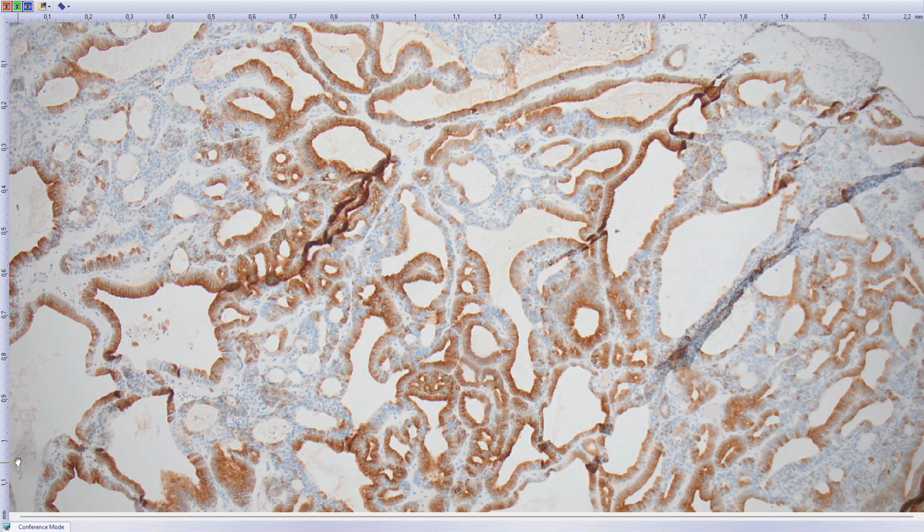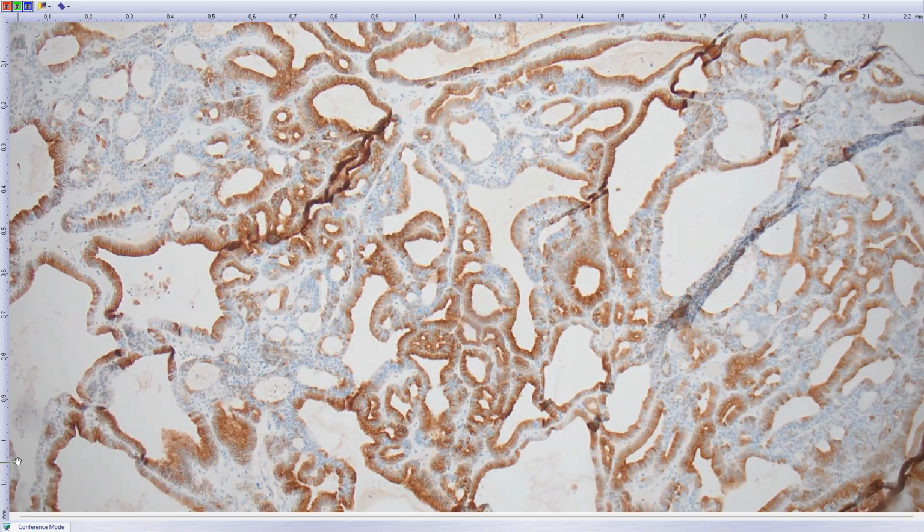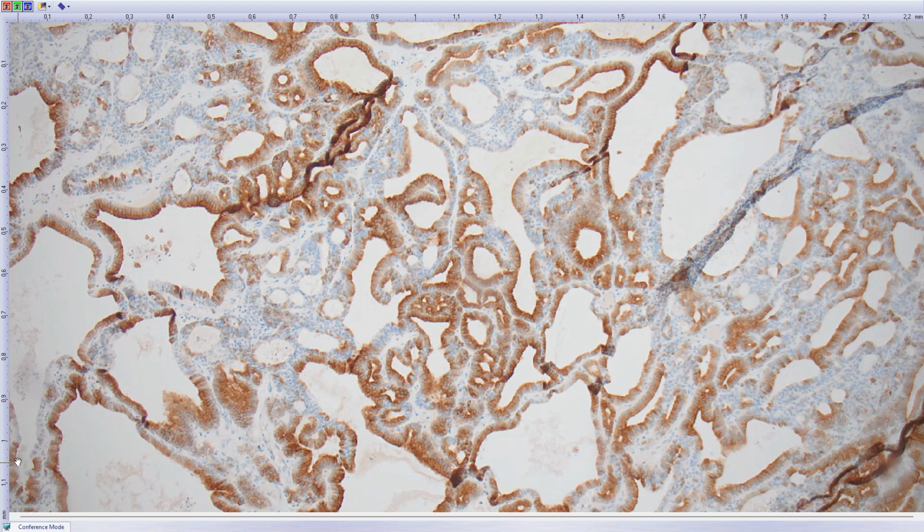Even if high-grade dysplasia is present, the prognosis of these pyloric gland adenomas is very, very good. There is essentially no progressive disease. I mean, sometimes they may even metastasize, but it's very, very, very rare.